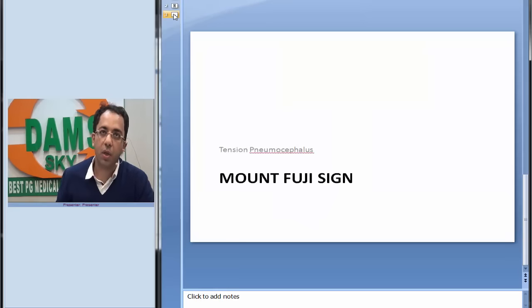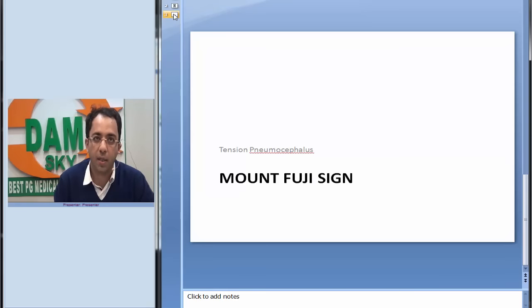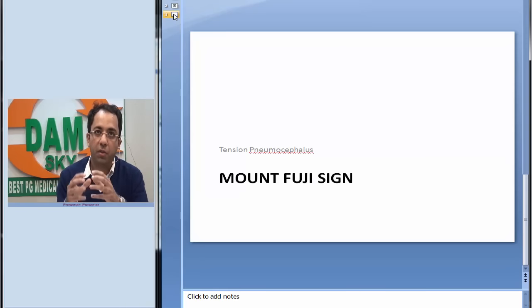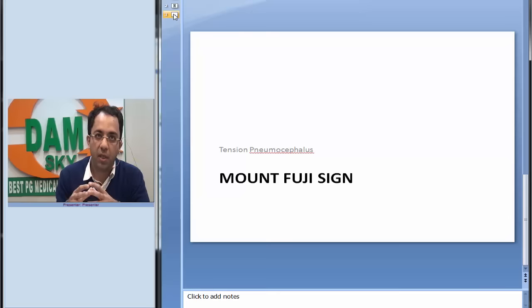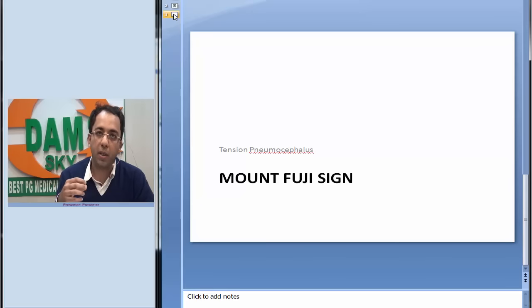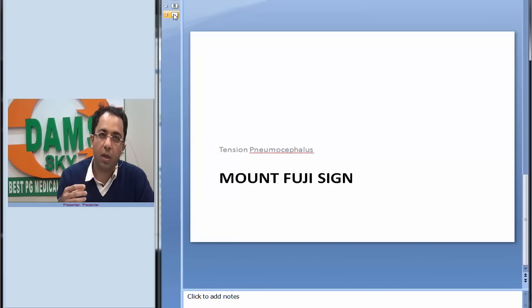This is the classic sign which is called the Mount Fuji sign, and it is diagnostic of tension pneumocephalus. The purpose of our radiology spotter series is to collect a series of readily diagnosable images which speak for themselves and are useful for residents as well as undergraduates.